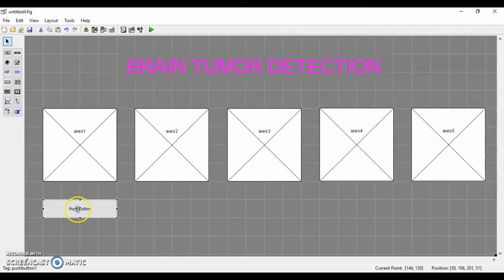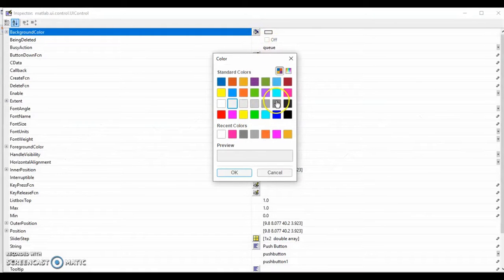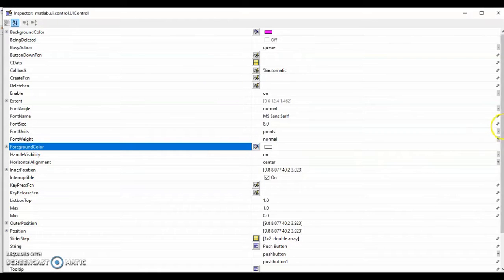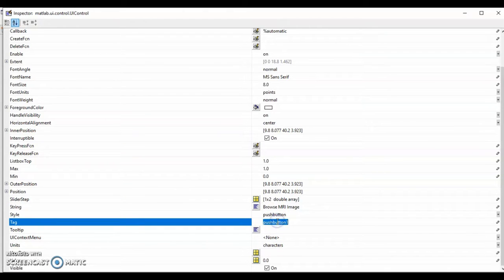By double clicking the push button, we can change the push button color, font size, style, and color of the push button. So we will change the background color of the push button to purple color and change the foreground color to white color. We will then change the title of the push button 1 to browse MRI image and change the tag to browse MRI image 2.